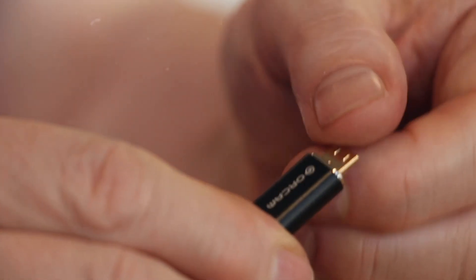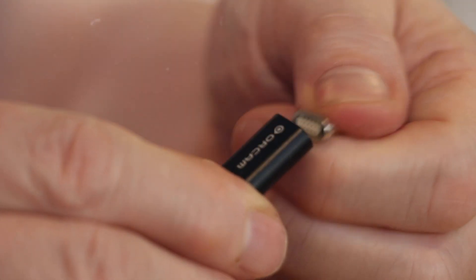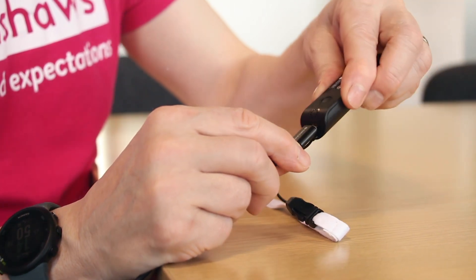OrCam listens to customer feedback — when version 1 came out with a cable connecting the camera, everyone said it'd be brilliant if it were wireless. Now it is. Another underrated but brilliant feature is the magnetic charging connector. It must have cost a fortune to develop, but it enables people with visual impairments to easily charge the device without having to fiddle with fiddly connections — it just sticks on. It's fantastic.